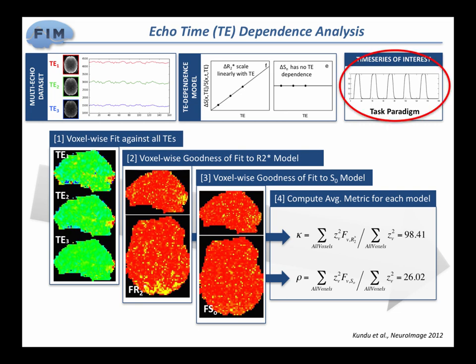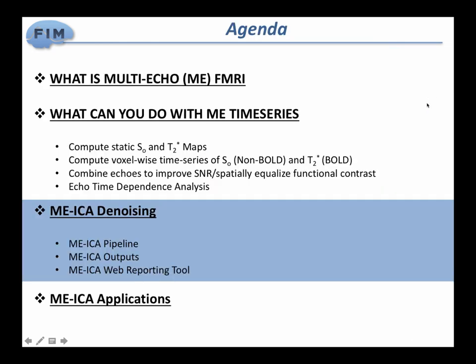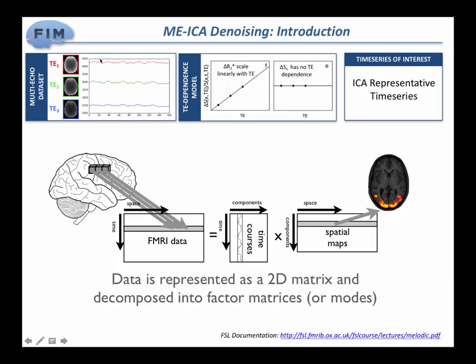Okay, so it's not always that we're going to have a candidate like this, especially if we're doing resting state, so what signals do I go looking for? One way to do that, and that brings me to MEICA, which is basically this combined with ICA, is to say, okay, I have my multi-echo data because I acquired it that way. If I didn't, then you cannot do this. There are many other things you can do to denoise your data in automatic ways. We have this physical model that we've learned, that that's how things should work.